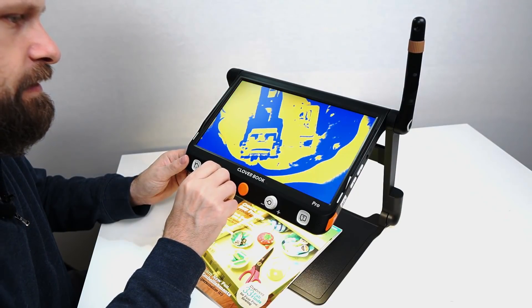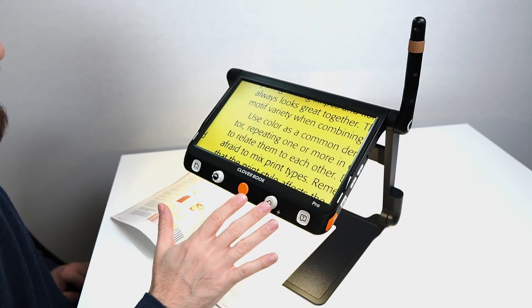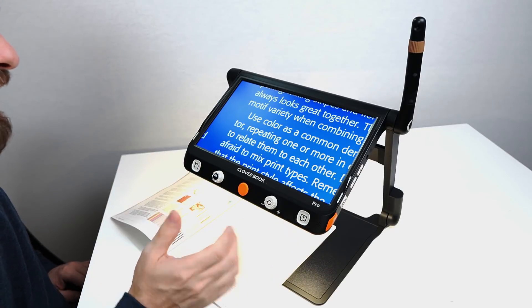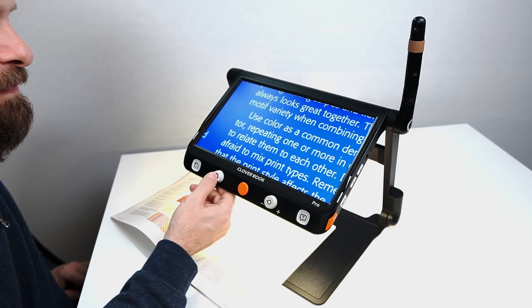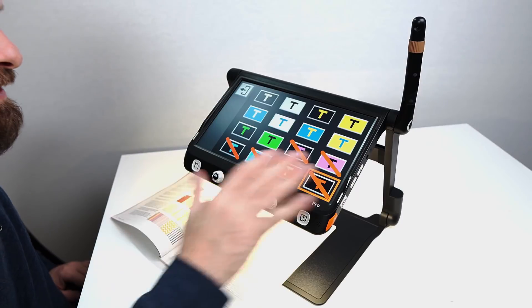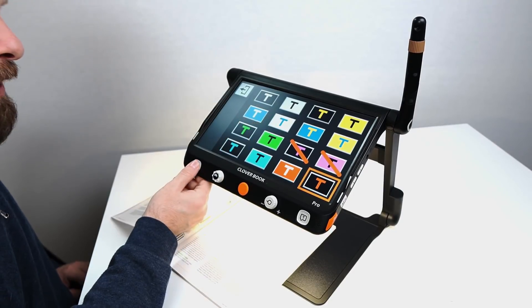You can cycle through all the different color filters and then tap that button to go right back to color. You can also customize these colors — say you're never going to use white on blue, just long-press the color button, go into 'Customize Color Combination,' and you can turn individual color combinations off or bring them back just by tapping on them. Tap the home button to go back to live view.